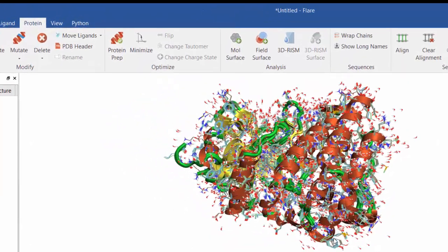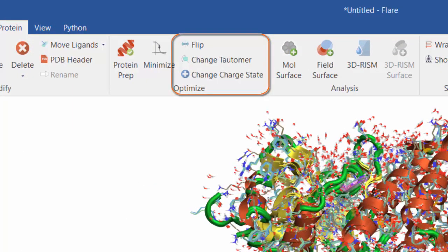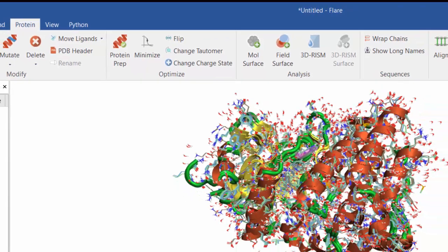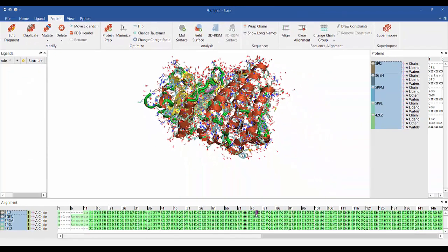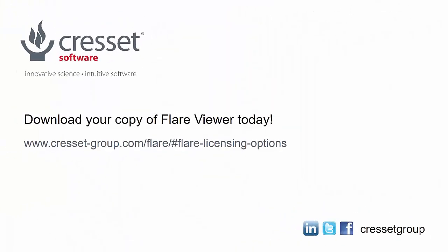Optimize your protein structures by flipping flexible residues or changing tautomeric and charge states for relevant residues. For more information on the available licensing options of Flare and to download the application, please visit our website. Thank you.